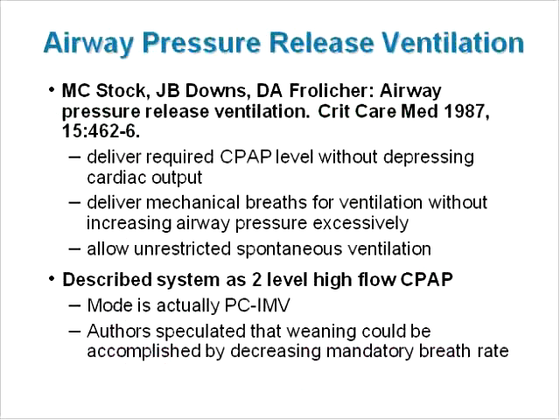Whether they knew it or not, they essentially reproduced an infant ventilator that provided time-triggered, pressure-targeted, time-cycled breaths. But the authors conceived of APRV as being a system that provided two levels of CPAP rather than what it actually was and is, pressure-controlled intermittent mandatory ventilation. That conception of APRV has continued to the present and is even reflected in the way operator interfaces are designed on current ventilators that offer the APRV mode.